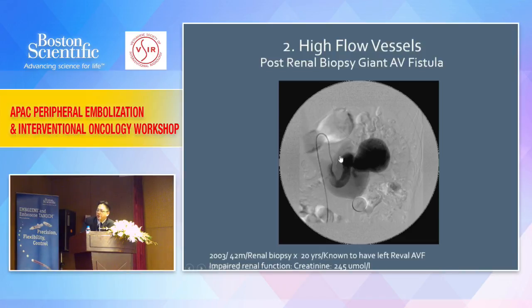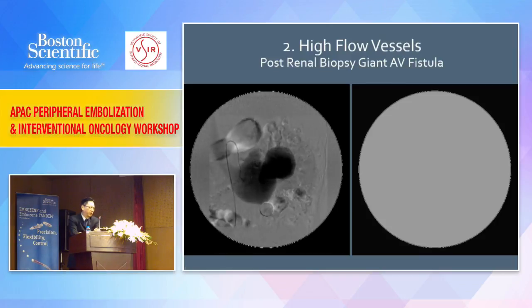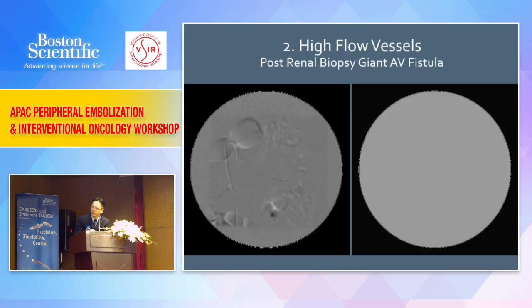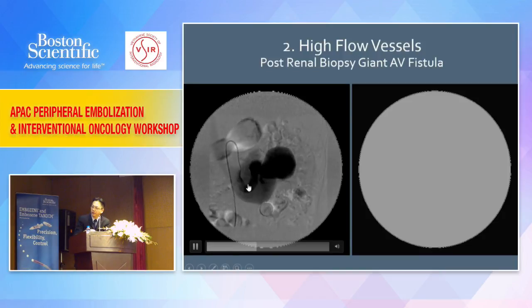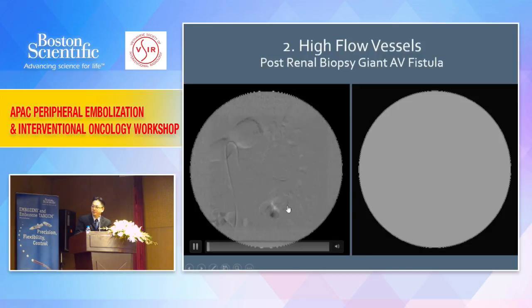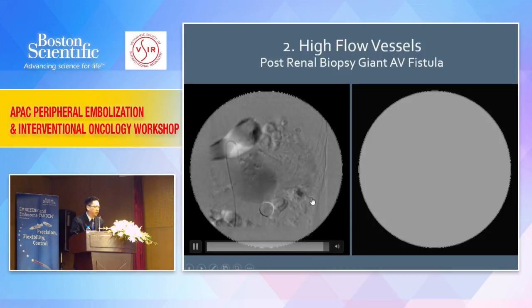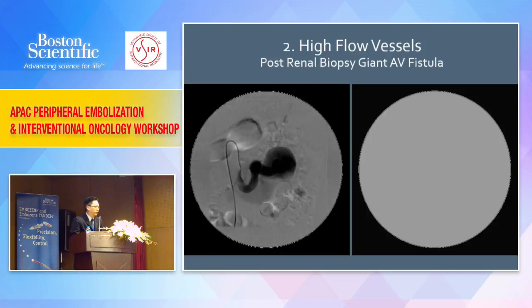Left kidney, what we are seeing is this big AV fistula with the feeding artery at 14 mm. This pedicle is 14 mm, okay? 14 millimeter, the size of the aorta. This aneurysm is 4 cm, all right? This fistula with aneurysm 4 cm. What will you do? In 2003, how are you going to do this? If you take the patient to theater, the only solution is nephrectomy.